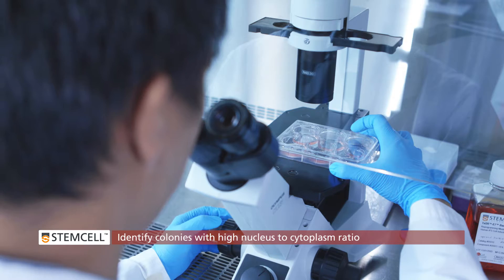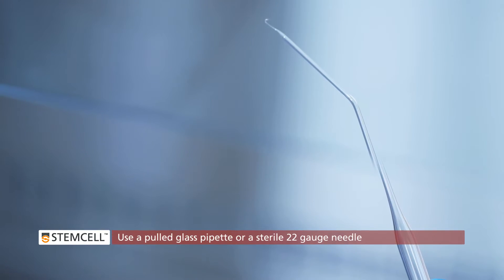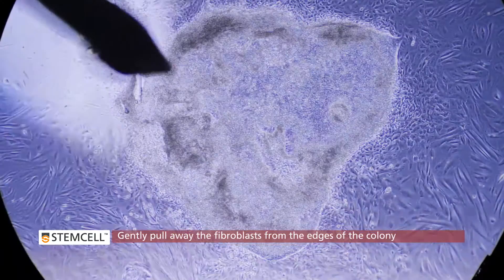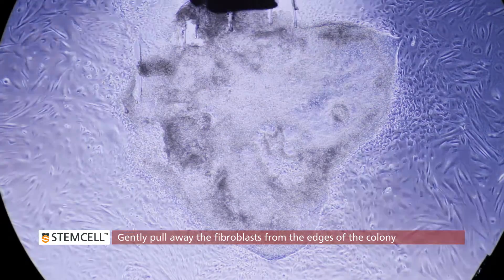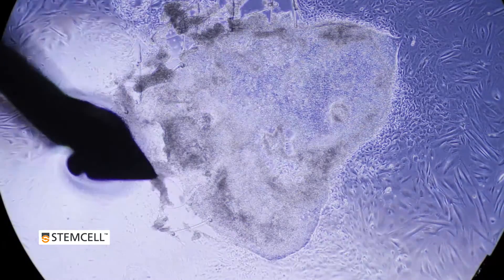Under a microscope, identify the colony you want to harvest. Using a pulled glass pipette or a sterile 22-gauge needle, gently pull the surrounding fibroblasts away from the edges of the colony. Be very careful to place the tip of the needle on the edge of the colony so that you don't damage the reprogrammed cells.